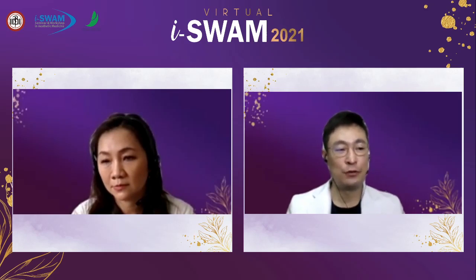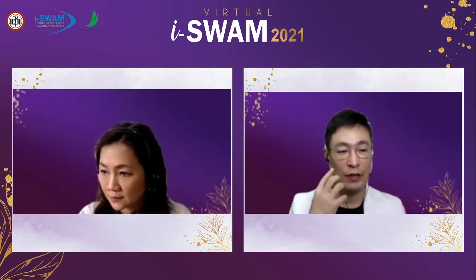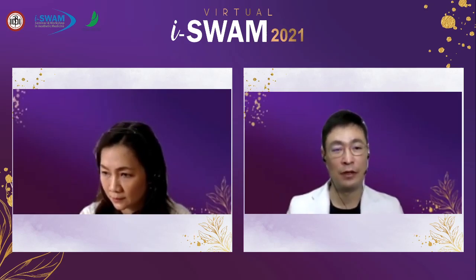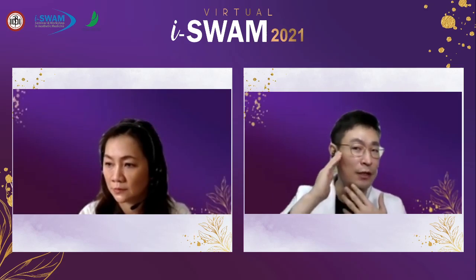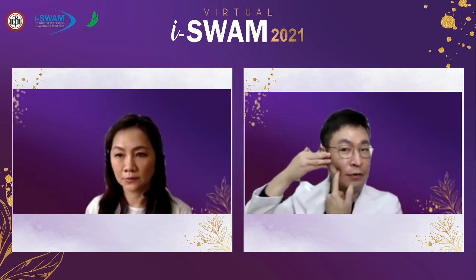Usually, there's no need to fix all small dimples on the treated area, but if there is a strong dimple, meaning you can see it without moving, using expression muscles, or you see a prominent dimple, then it's better to release it before finishing the treatment. To release the dimple, usually I pull the entry point. If you pull the entry point, you will see a more definite dimple.